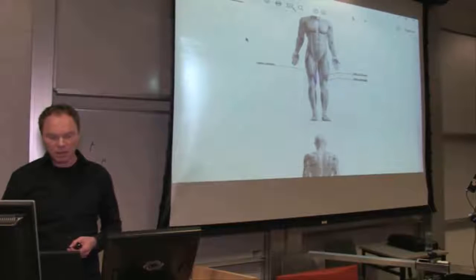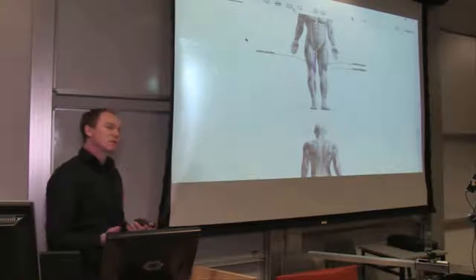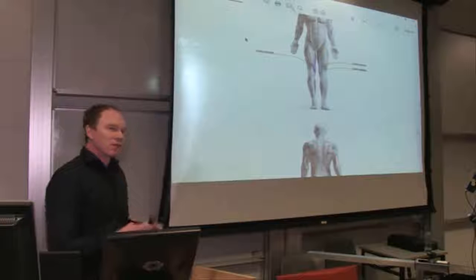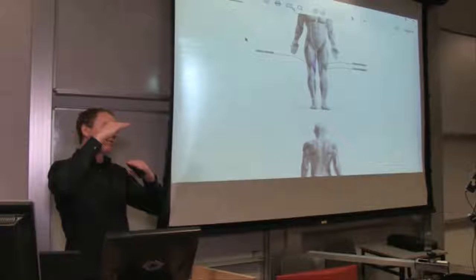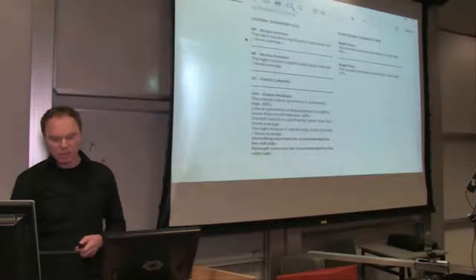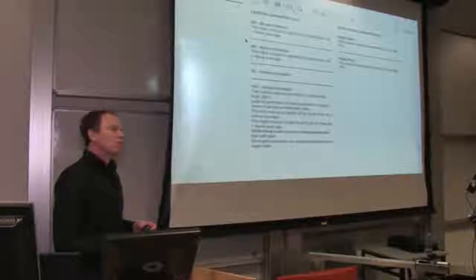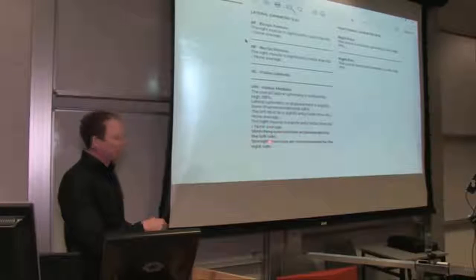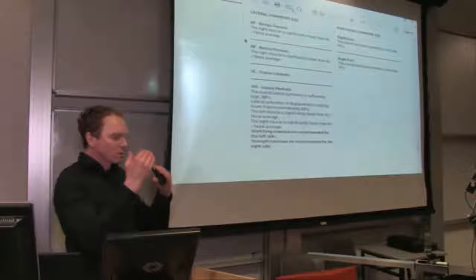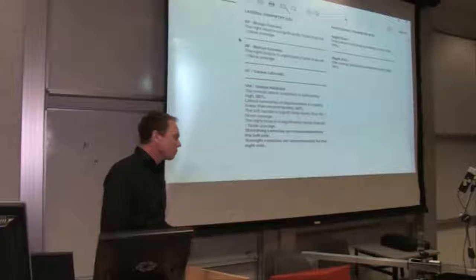So when you look at the recommendations, you will get that one of the vastus medialis needs to be toned up a little bit, and one of the vastus medialis needs to be stretched or relaxed. This is because of the difference of displacement that was displayed. From the speed of contraction point of view, everything was perfect. This is then explained here. It tells you, okay, you have a displacement difference which is bigger than it should be, so the one that is too stiff needs to be stretched, the one that is too loose needs to be toned up. The goal is to balance out these differences. But overall, I would say, yeah, quite a nice result.